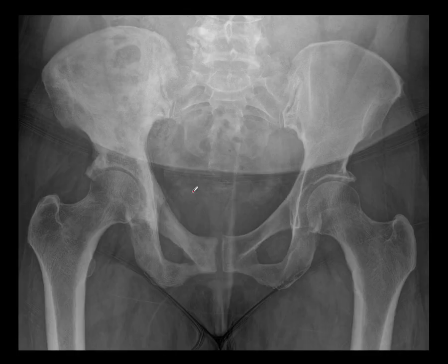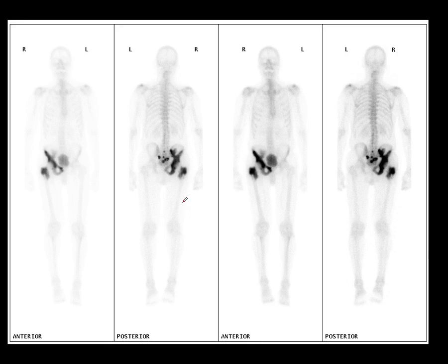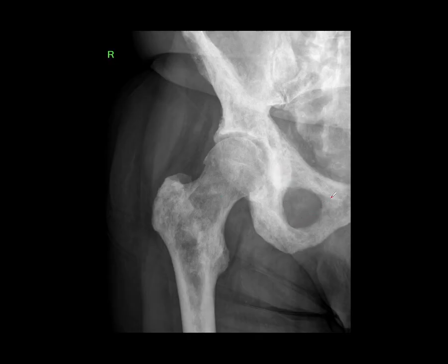Here's a patient with metastases who is rather difficult because this does look a little like Paget's disease. Fortunately, there are multiple focal areas of metastatic disease elsewhere, which allow us to make the diagnosis of metastases — but I can see how it might be difficult if this were the only site of uptake. On the pelvic radiograph, we don't have thickened trabeculae — just an irregular diffuse increase in bone density, rather different from the classic Paget's appearance.